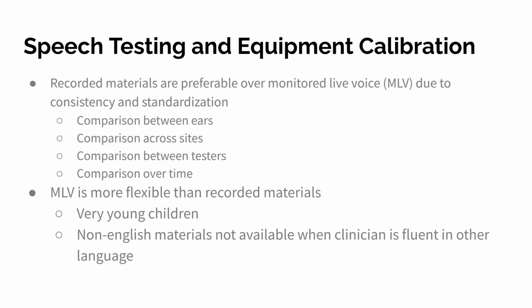Recorded materials are preferable over monitored live voice due to consistency and standardization. It's easier to compare across ears, across sites, across testers, over time. The benefit of monitored live voice is that it's more flexible than recorded materials.